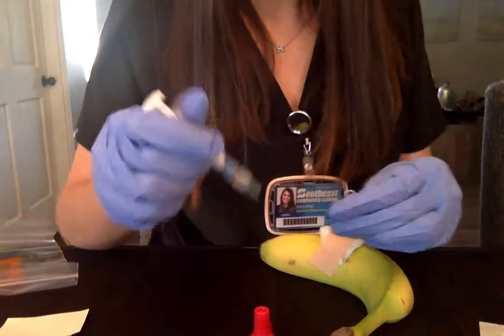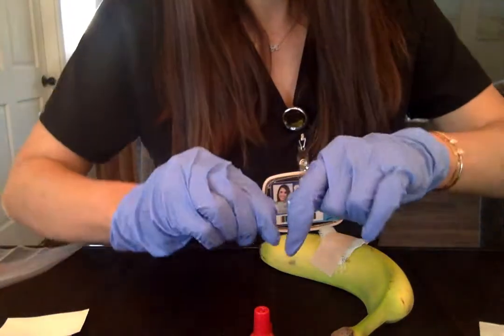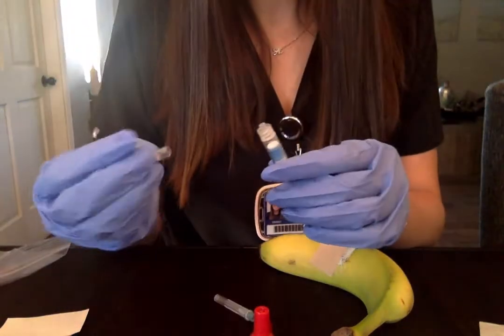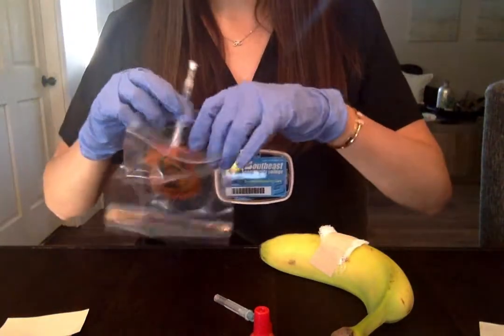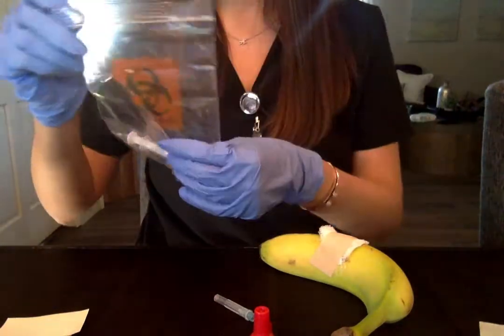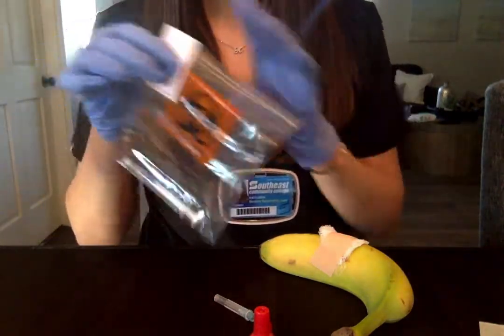Assuming that would be stuck in the cork, I would have my sample. I would just put the lid on it, then label it accordingly with all the information it needs, and then put it in the biohazard bag and send it to the lab.